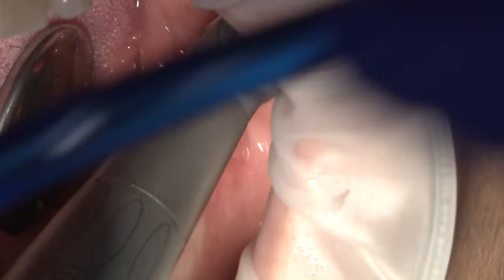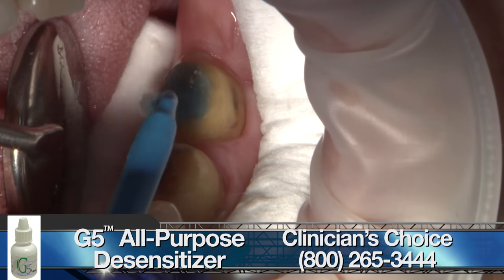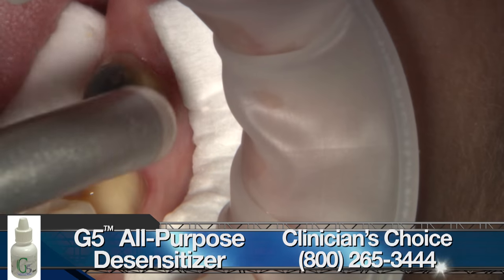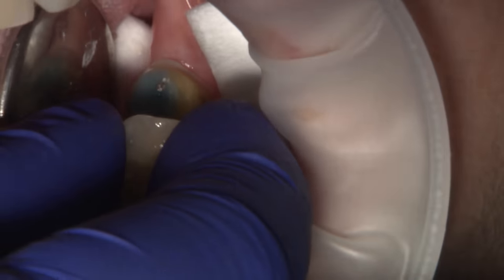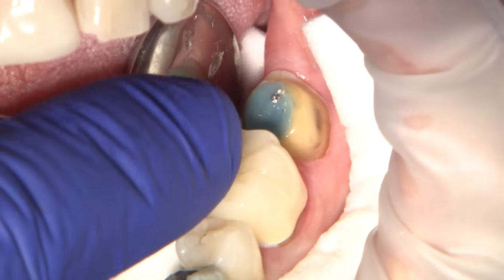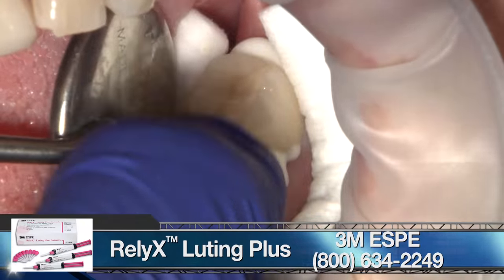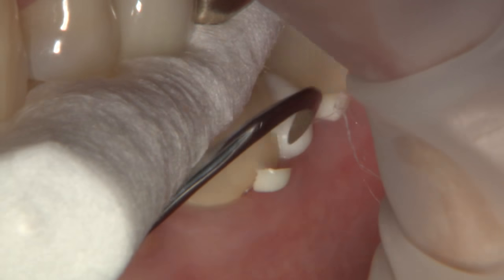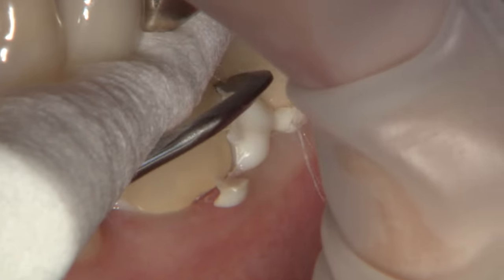crowns ready for cementation. I always apply G5 before cementation, even on an endodontically treated tooth, because it is believed to have an antibacterial effect and seems to prevent bacterial growth between the tooth and the restoration interface. When cementing metal restorations, I prefer Relyx Luting Plus. It is a resin-modified glass ionomer self-curing cement that has a tack and wave light curing option, making it very easy to clean up the excess.